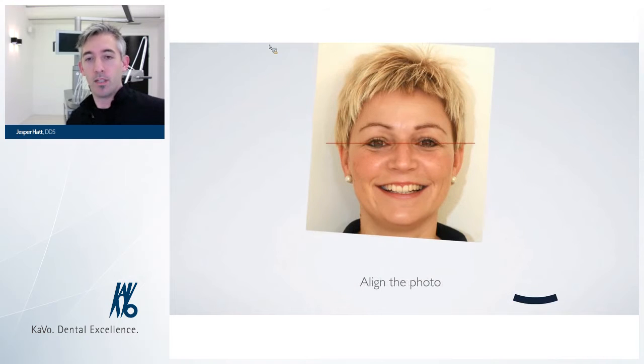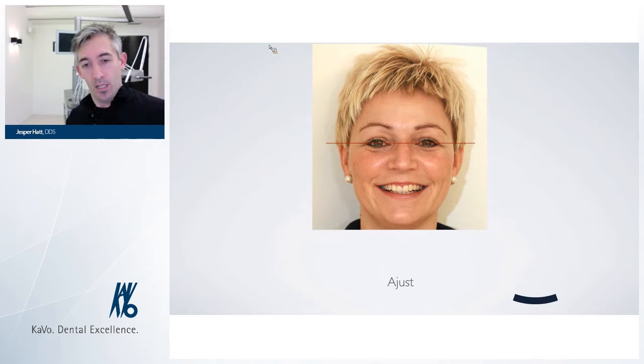So we have the picture just right through the eyes, or the line through the eyes right now. And we make a correction of the picture. So that's adjusted like that. And then we take the first intraoral photo.